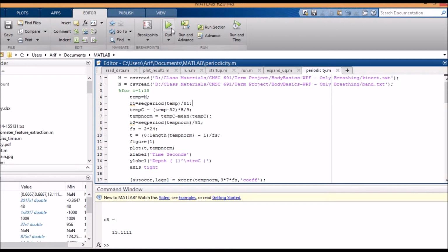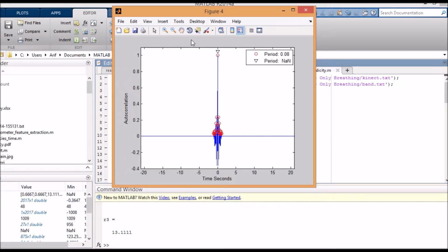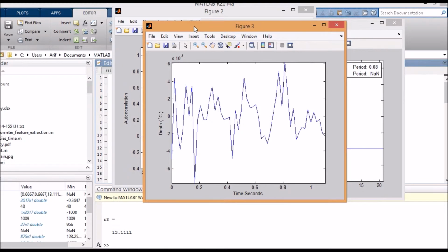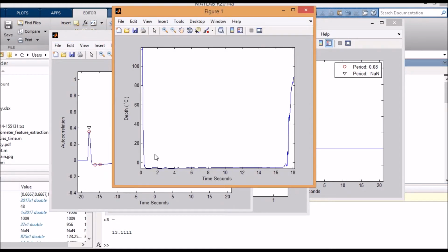So let's calculate the respiration rate using both of the Kinect and band sensor provided information. First we can see here are all the graphs. In figure 1 we can see the depth information, where it is really impossible to calculate any kind of oscillation using just this information. So we use the autocorrelation.